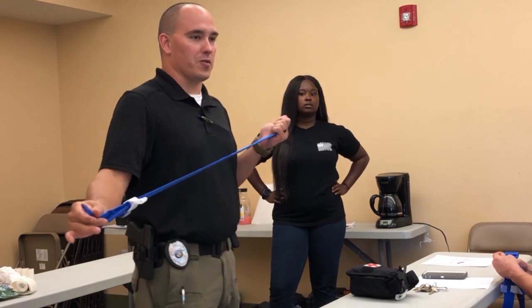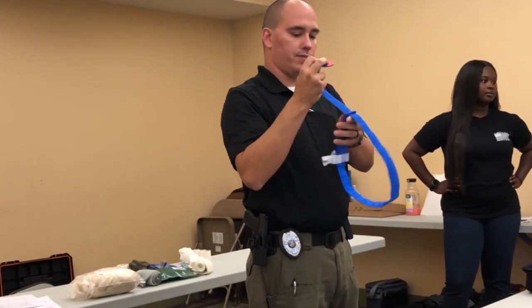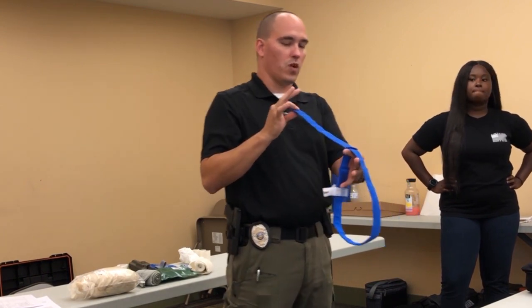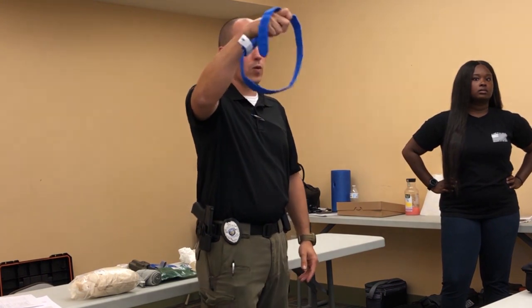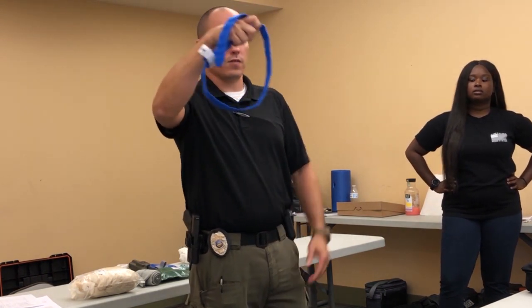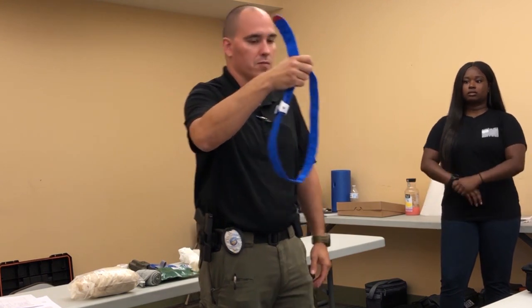I'm going to show you how to stage it. Starting at the red part, give yourself roughly 10 inches. You want this loop to be big enough to go around your biggest limb — if you've got bigger legs, you need a bigger loop; smaller legs, not as much.